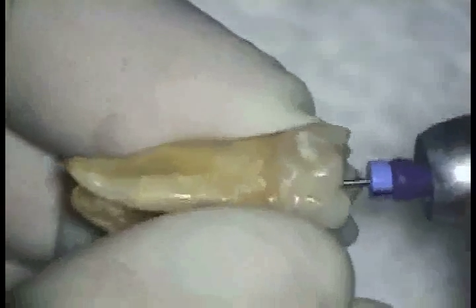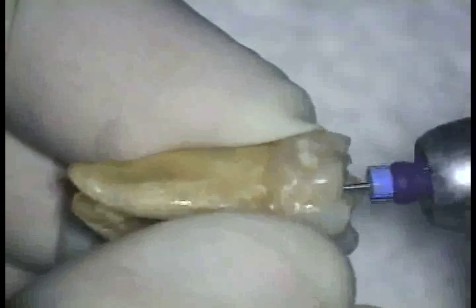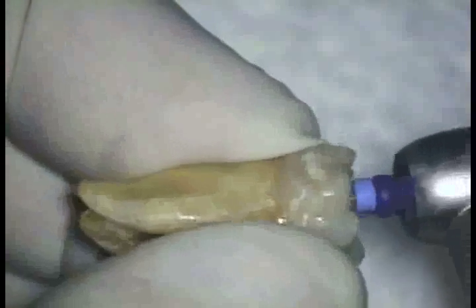Once patency is attained with the 08 REMA, the measurement of the canal is taken and the 10 REMA is used in the 30-degree reciprocating handpiece to the same length as the 08 REMA. Note the bend in the REMA that has recorded the curvature of the canal.